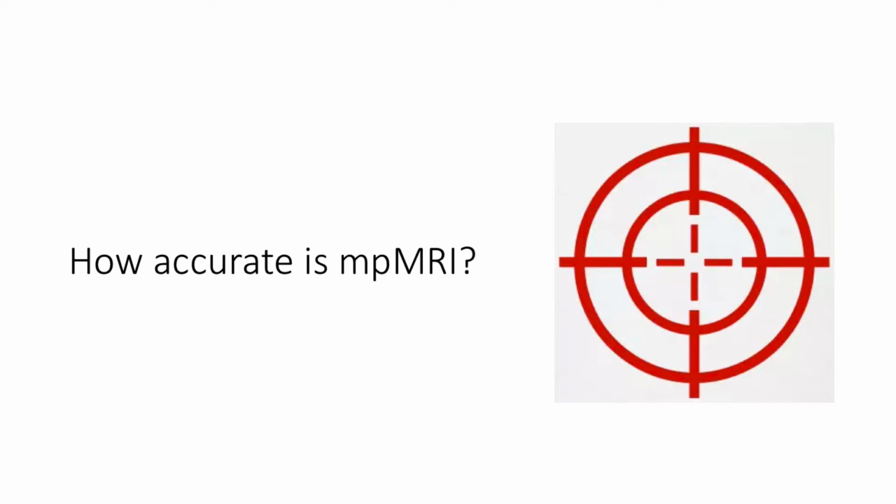Most studies are saying that you can probably get away without contrast, except the most recent one from radiology, saying it's been quite helpful, and that was a prospective multicenter trial. So we need to investigate that a little bit further. We looked at our own data, 1.5 tesla, I think over 100 lesions, and we found that contrast wasn't essential, so we maybe need to get away without contrast in these patients.